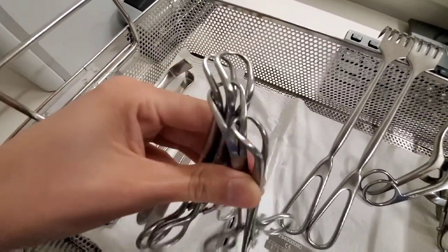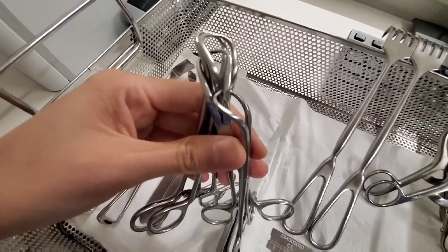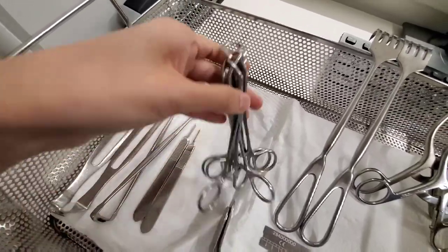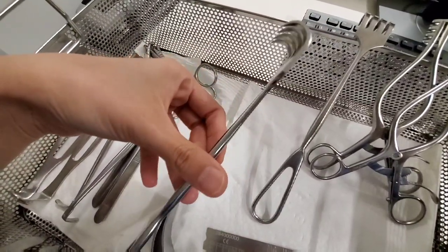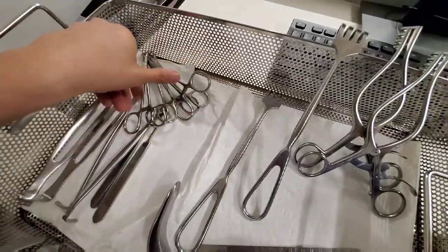These are towel clips — they're used in orthopedic or to clamp towels when they drape. These are rakes, sharp rakes, mainly used in orthopedic like total knee arthroplasty.